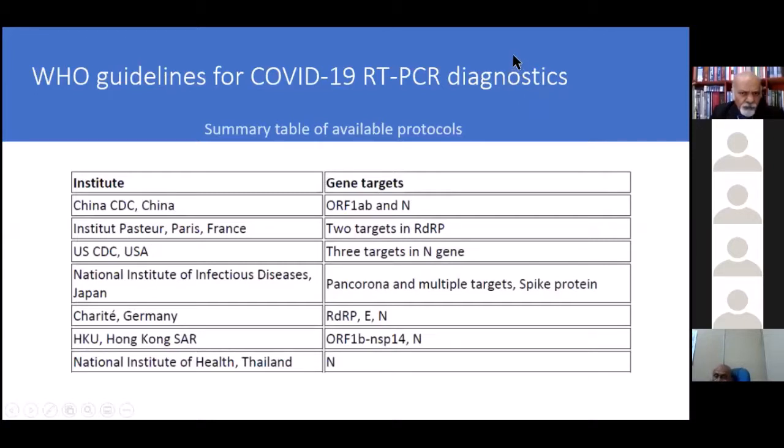This table summarizes the available in-house protocols developed by these various institutions. However, WHO stressed that being listed in this document does not imply any endorsement or validation by the WHO. And as you can see, these different protocols target different selected genes of the SARS-CoV-2 virus.